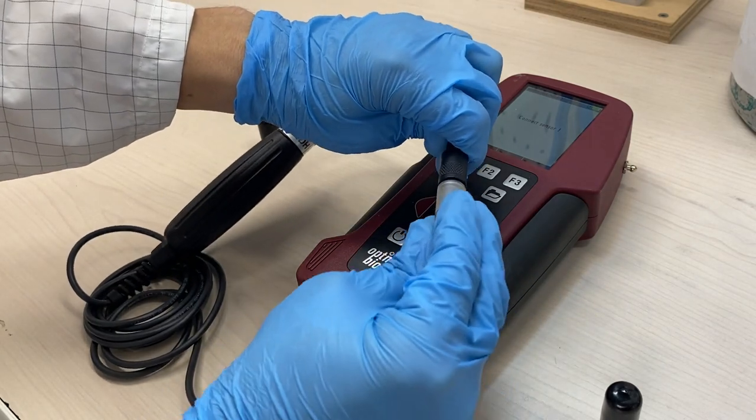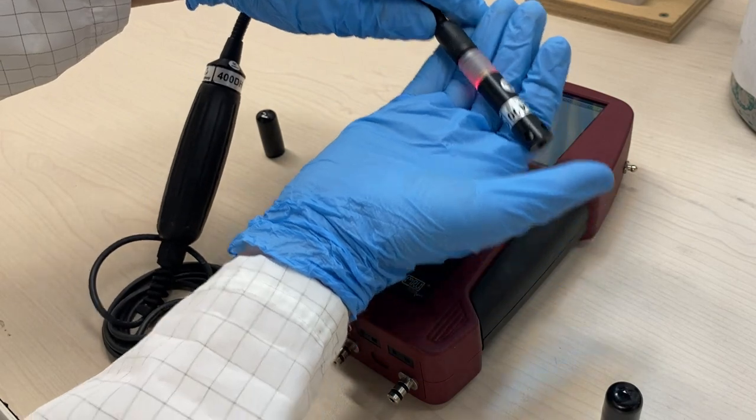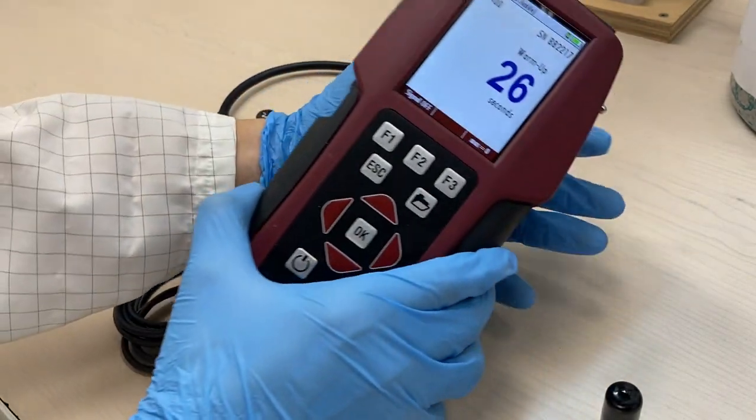The sensor will blink a red light for about 30 seconds, indicating that it is going through its warm-up phase.